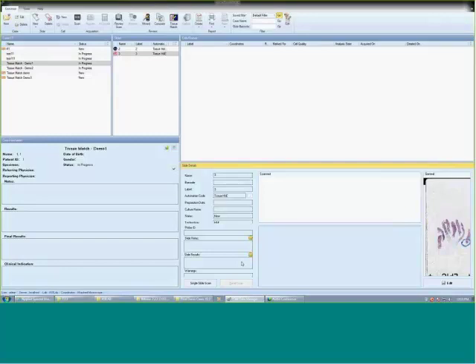In addition, this demo will be divided into two sections. In the first part, I will be playing the role of the pathologist, where I will mark the H&E slide. In the second part, I will play the role of the technician, where I will match the slides. So I will now be the pathologist.